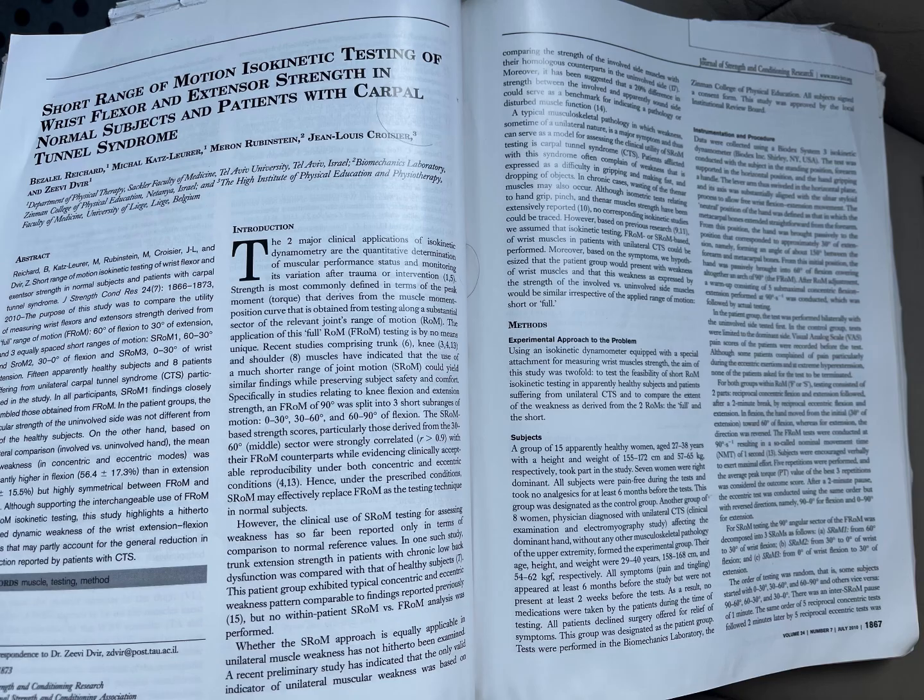We're going to skip the abstract for now. Introduction. The two major clinical applications of isokinetic dynamometry are the quantitative determination of muscular performance status and monitoring its variation after trauma or intervention. Strength is most commonly defined in terms of the peak moment torque derived from the muscle moment position curve that is obtained from testing along a substantial sector of the relevant joint's range of motion, ROM.